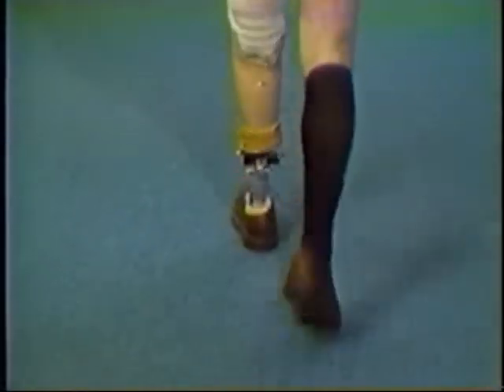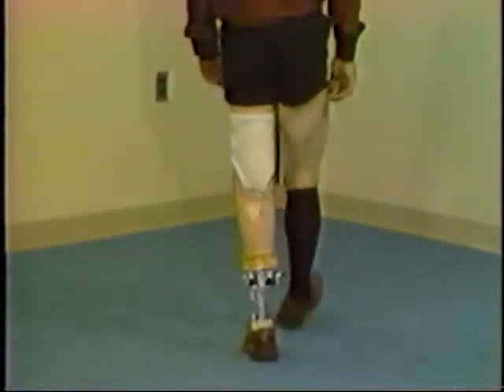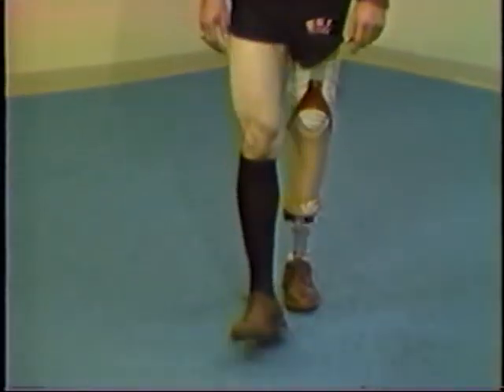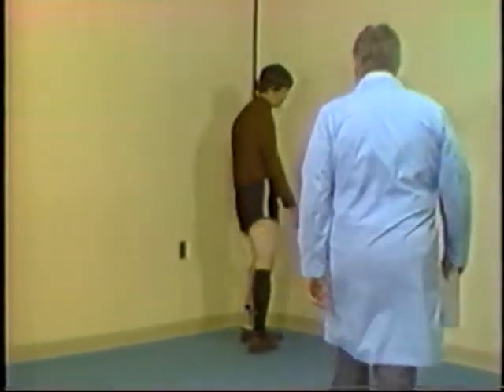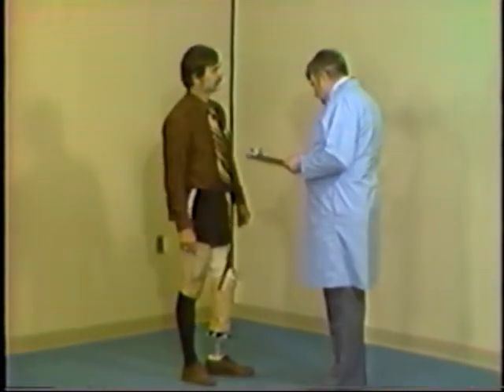Dynamic alignment must be accomplished by viewing locomotion from two different perspectives. First, you must observe the amputee walking away from you and toward you as you observe the interaction of socket, pylon, and foot. Make sure you talk with the amputee throughout the process of dynamic alignment. You will gain valuable information about excessive pressure and impressions from the amputee, which helps develop a cooperative and trusting relationship.